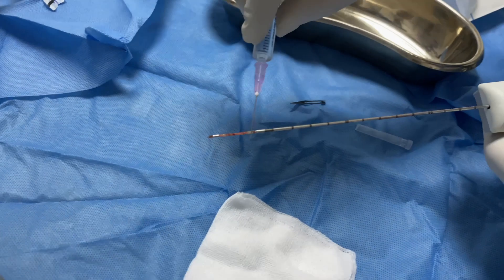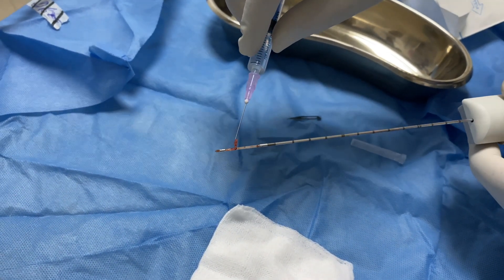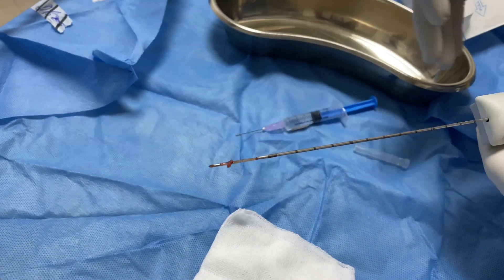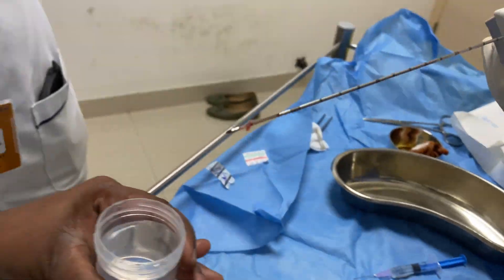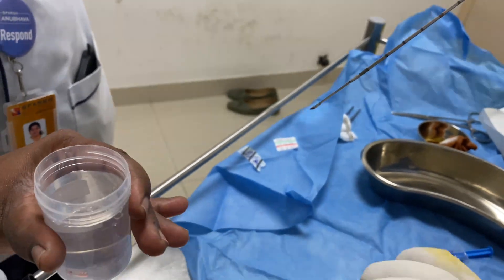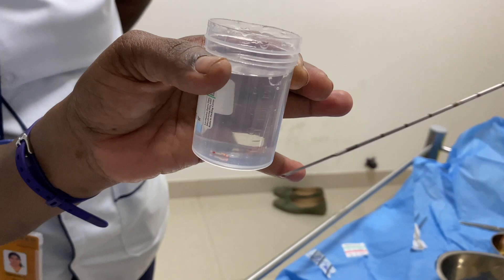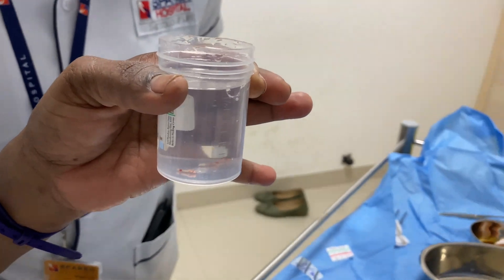Pull the top slide back to expose the biopsy sample notch — here you find a nice piece of tissue sample. Dip it in the small formalin container. The tissue should sink to the bottom; if it's fat, it will float.